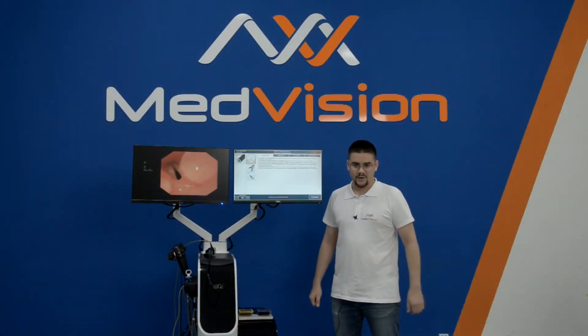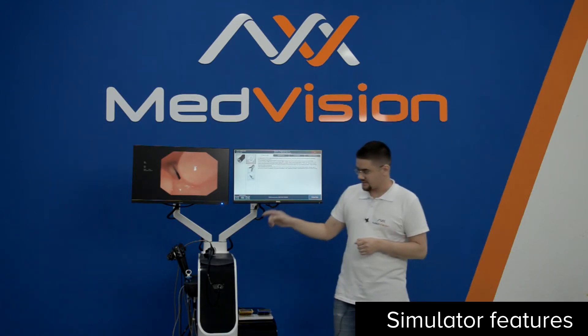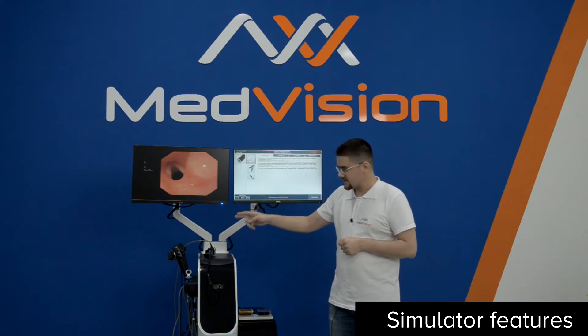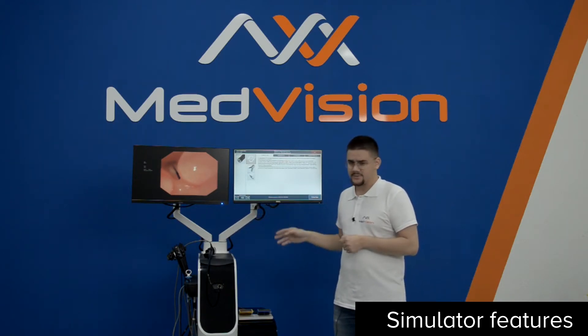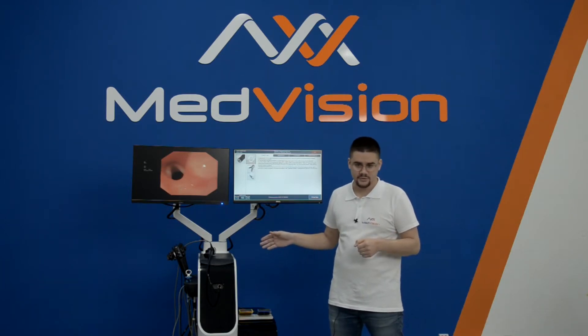EndoVision is an all-in-one platform that can be purchased in different options. For example, this one is a three-in-one simulator where we have gastroscopy, colonoscopy, and bronchoscopy. They can be purchased separately — the instruments and the modules — or you can have a two-in-one or again separately.